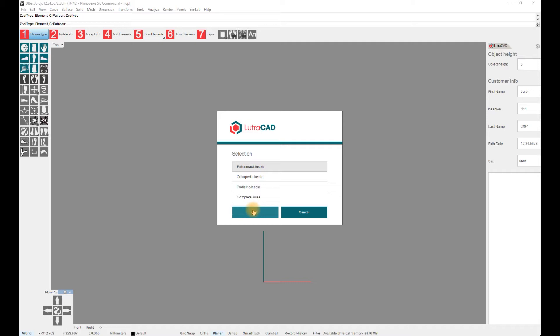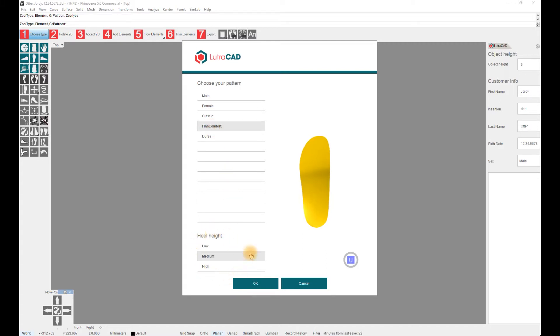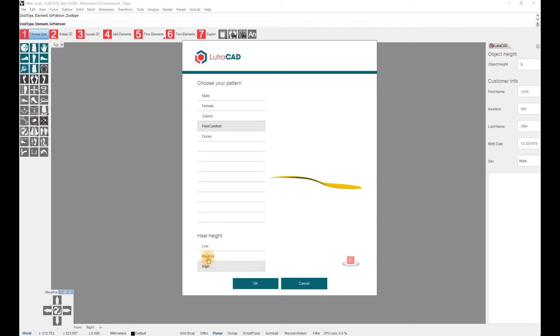To make an insole based on a 3D scan, we have to choose Full Contact Insole. A new screen will appear where you will choose your insole pattern. Press OK.